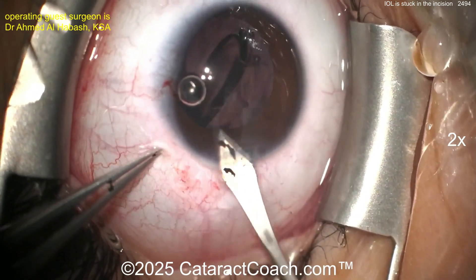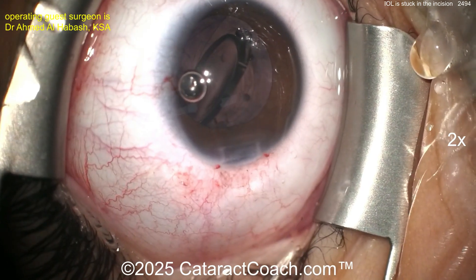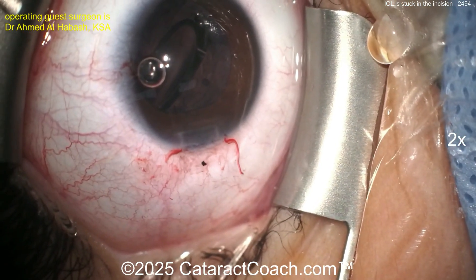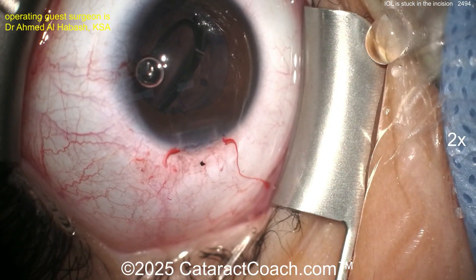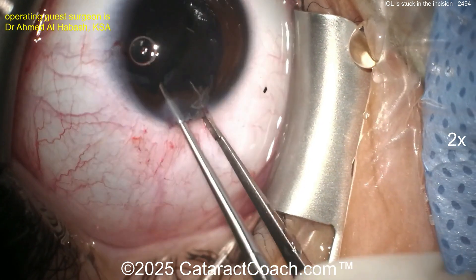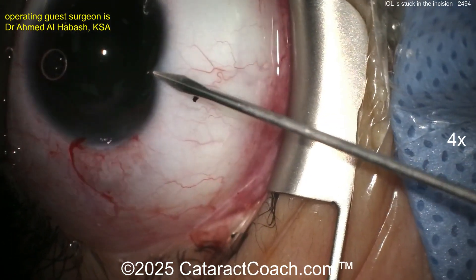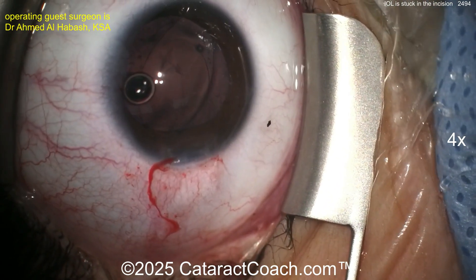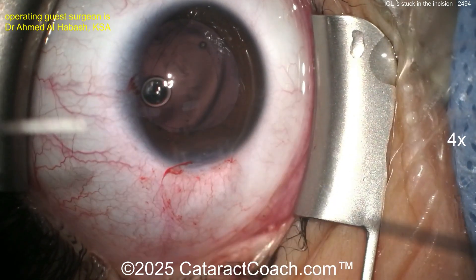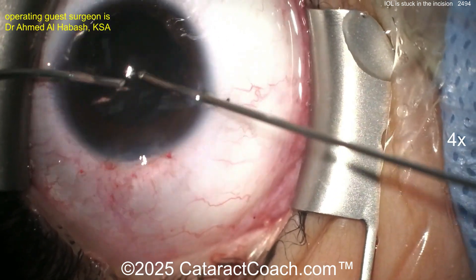I like the pause — think about what you want to do. Let's enlarge the incision, that's a good move. You need to get that lens out, and once it's out you really need to get some triamcinolone to stain and see where the vitreous is, and do an anterior vitrectomy. The patient can still have a very good outcome. Here's removing the lens — just pulling it out — and now another paracentesis and manual anterior vitrectomy.